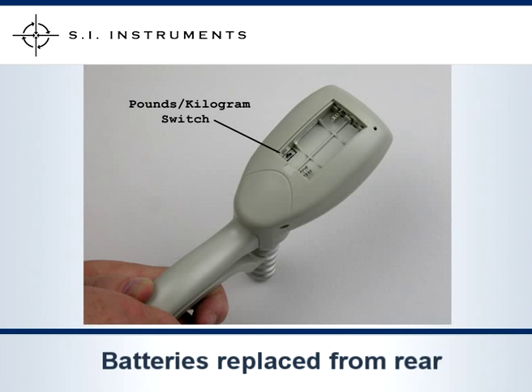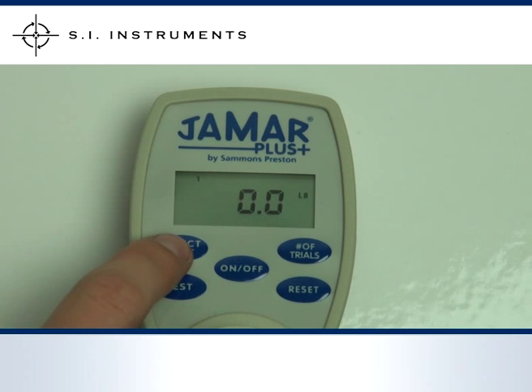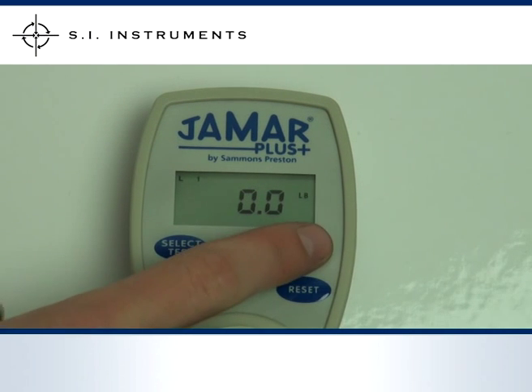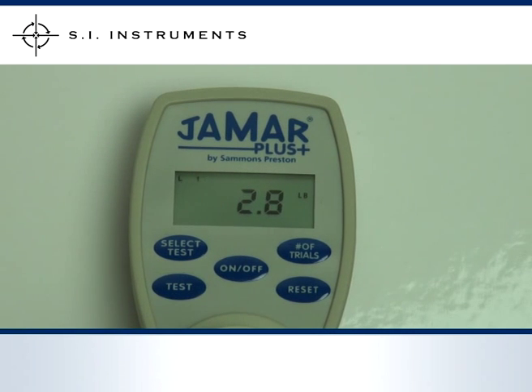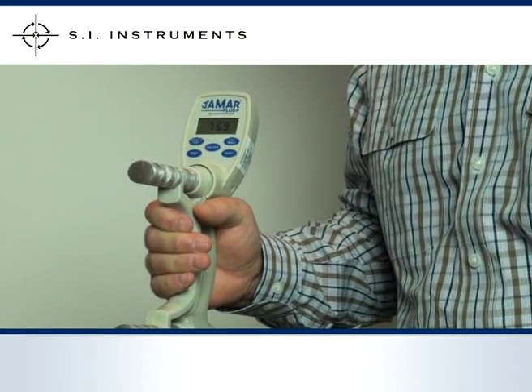The unit's batteries are installed via a cover on the rear of the display, which is also where the pound-kilogram selection switch is located. To operate a test, first specify the type and number of tests to be done and correctly position your hand on the unit. Then press the TEST key and squeeze the grip. Once complete, press the TEST key again to conduct the next test.